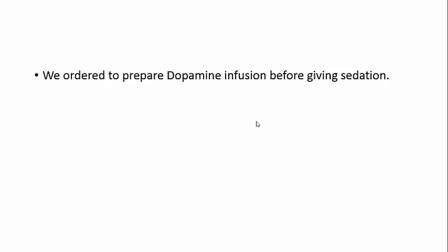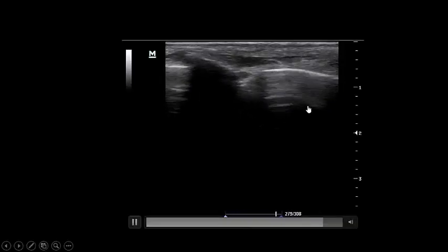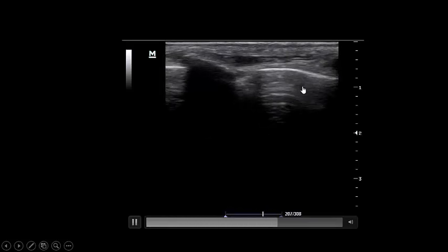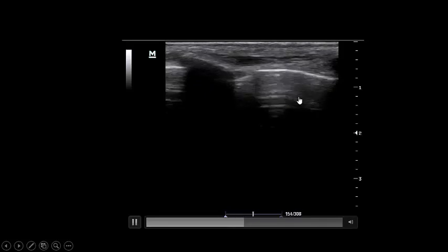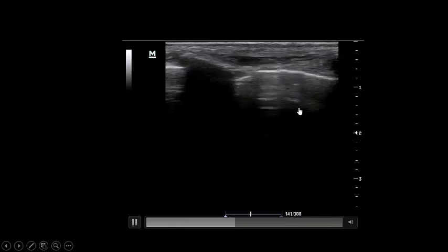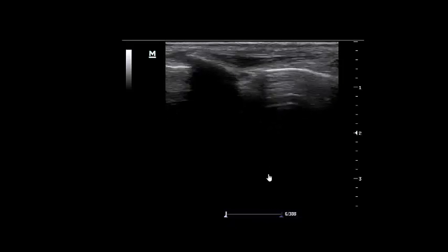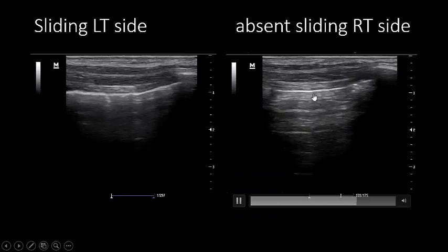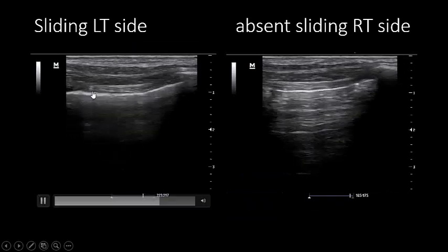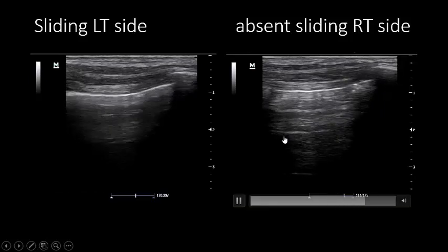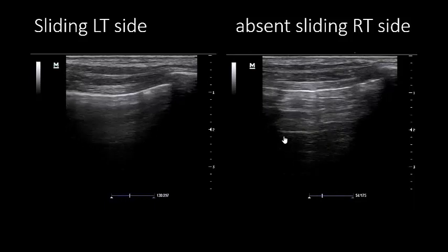Remember, the patient had diminished breath sounds on the right side. Here on the right lung, you can see no lung sliding. This is the rib shadow, this is the pleural line — there is up-and-down movement of the pleura due to respiratory distress and accessory muscle contraction, but no true sliding at all. Comparing with the left side: the left side shows very good sliding. So this patient has absent lung sliding on the right side. Absent sliding is sensitive but not specific for pneumothorax — it can occur in other pathologies.